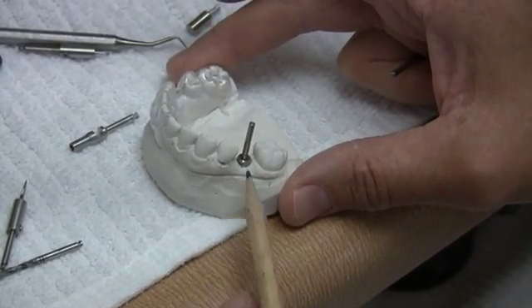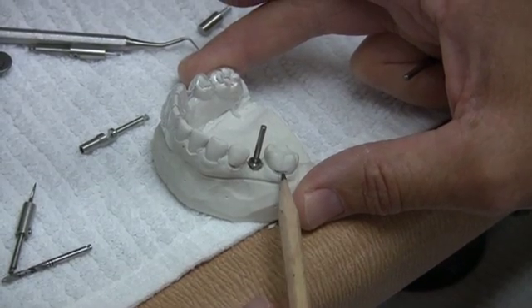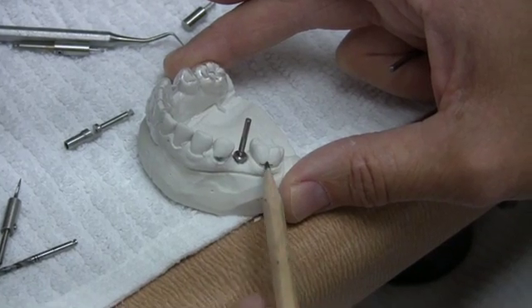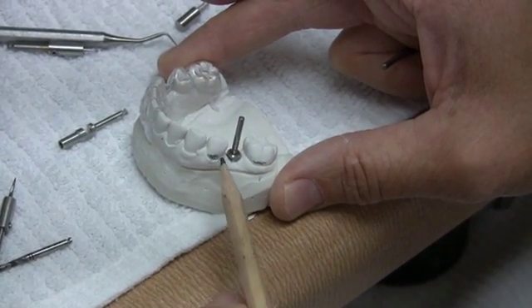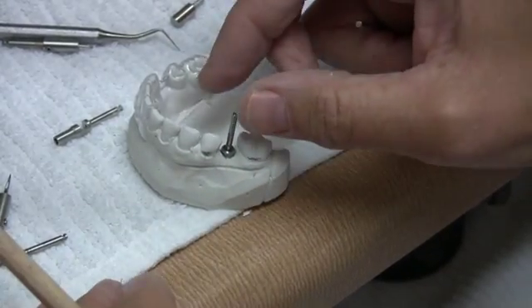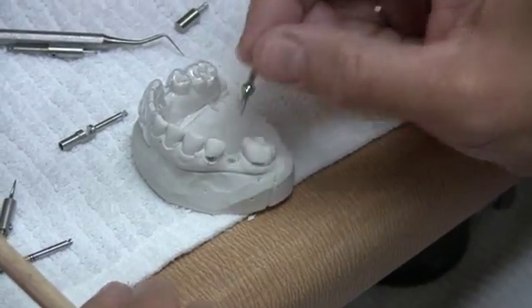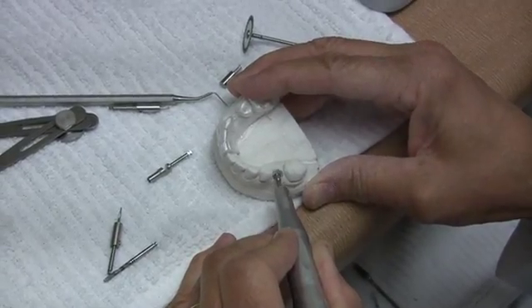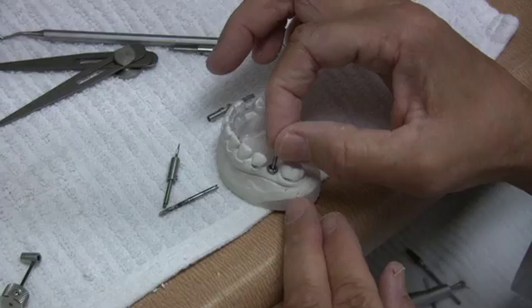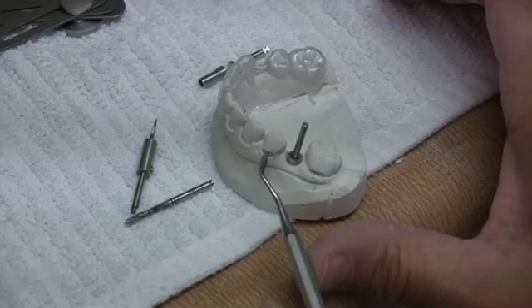For fabrication of aesthetic restorations, it is important to have the platform 1.5mm to 3mm apical to the CEJ of adjacent teeth. We can now evaluate the platform position in reference to the CEJ of the adjacent teeth. If we need the platform to be more apical, we can then modify or reduce the height of the bone on the crest and reinsert the gauge.